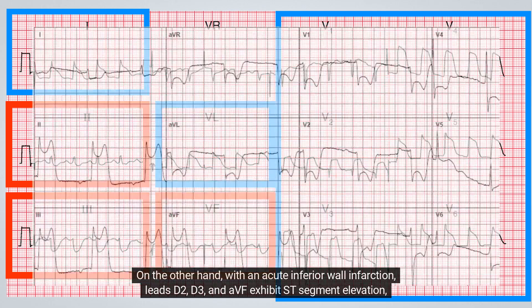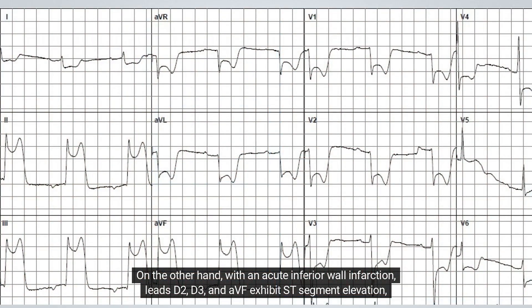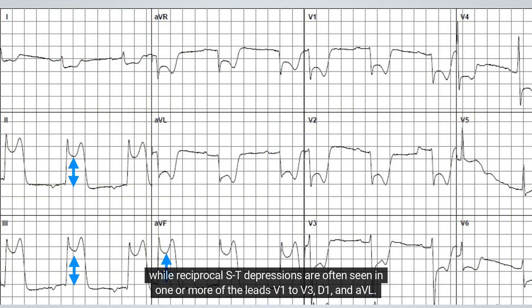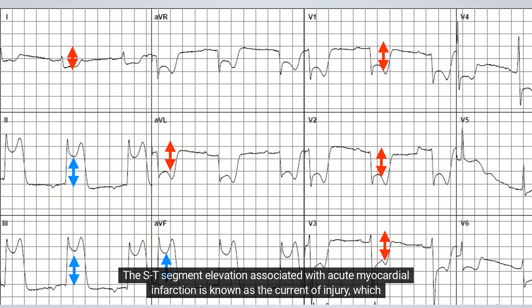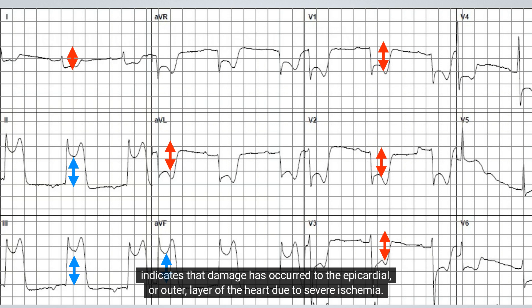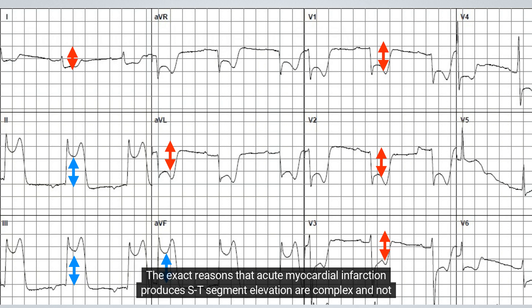On the other hand, with an acute inferior wall infarction, leads D2, D3, and aVF exhibit ST-segment elevation, while reciprocal ST depressions are often seen in one or more of the leads V1 to V3, D1, and aVL. The ST-segment elevation associated with acute myocardial infarction is known as the current of injury, which indicates that damage has occurred to the epicardial or outer layer of the heart due to severe ischemia.